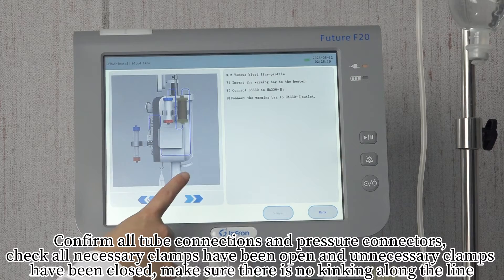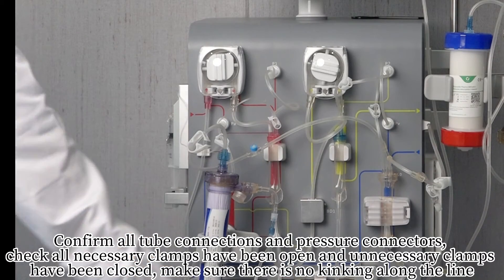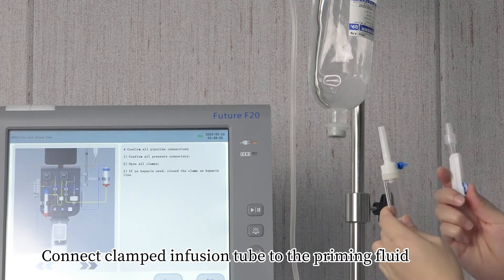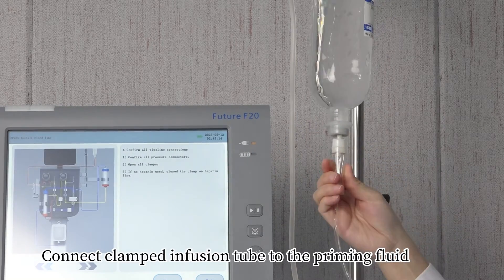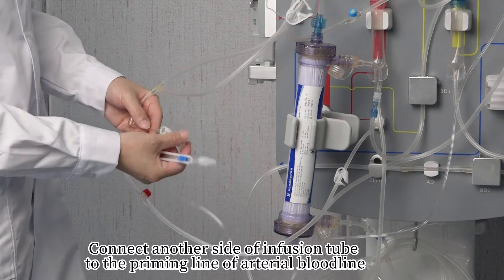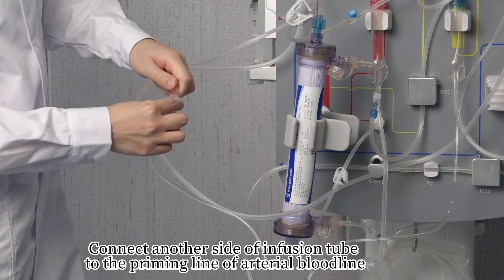Confirm all tube connections and pressure connectors. Check that all necessary clamps are open and unnecessary clamps are closed. Make sure there is no kinking along the line. Connect the clamped infusion tube to the priming fluid. Connect the other side of the infusion tube to the priming line of the arterial bloodline.